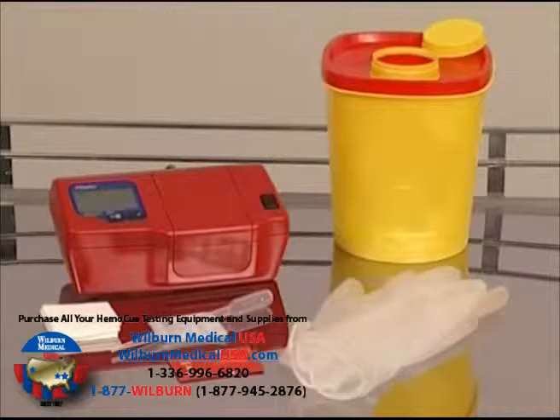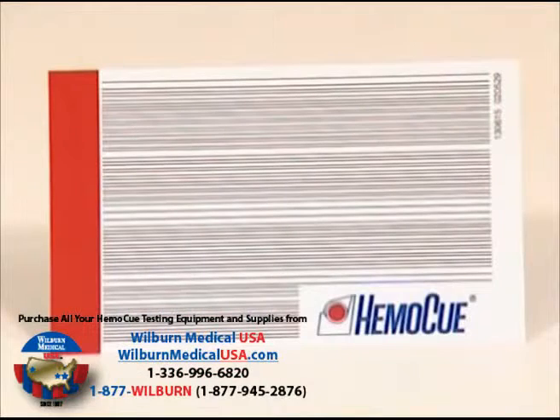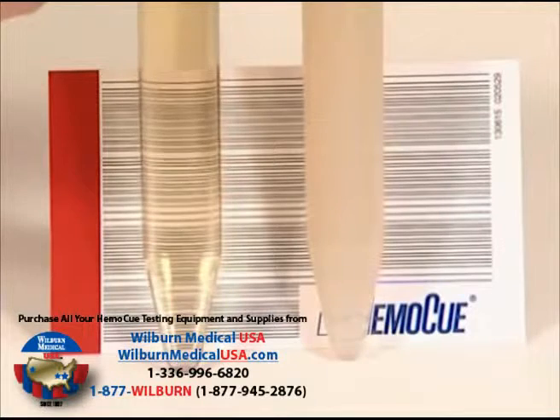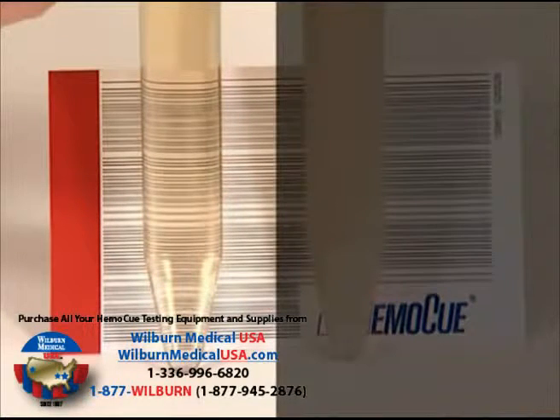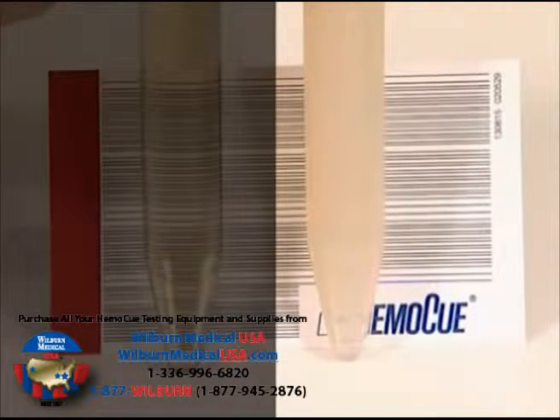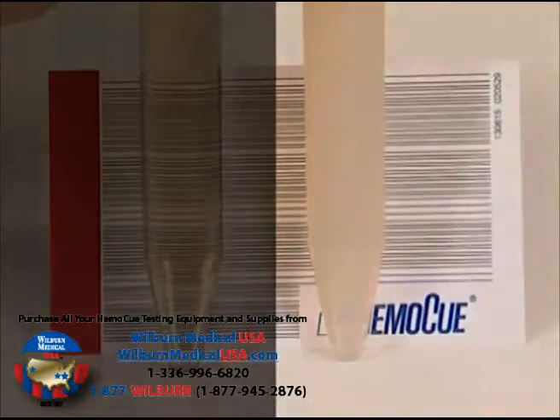Urine without additives may be used. Make sure all supplies are at hand. The turbidity scale in the operating manual can be used to determine the level of turbidity. Hold the turbidity scale right behind the sample. If the stripes can clearly be seen, proceed with the analysis. If the stripes are blurred, the sample should be centrifuged.